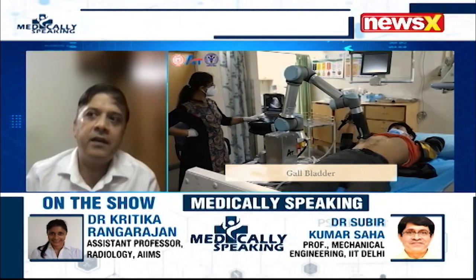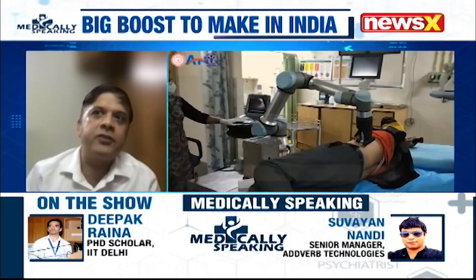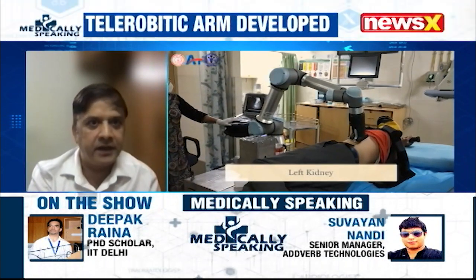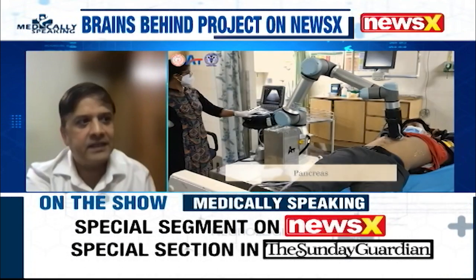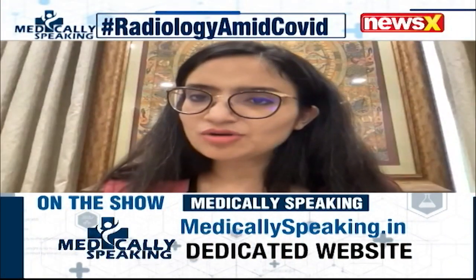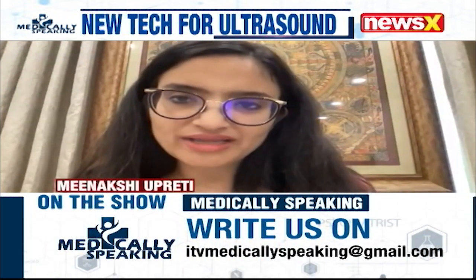So which means that with this kind of a device, the telerobotic device for the ultrasound, we can actually make the expert available in the rural areas. See, unlike in the X-ray kind of technology where, let's say... I get that. But then a lot, as I said, would depend on the costing, right? When you speak of rural areas, yes.